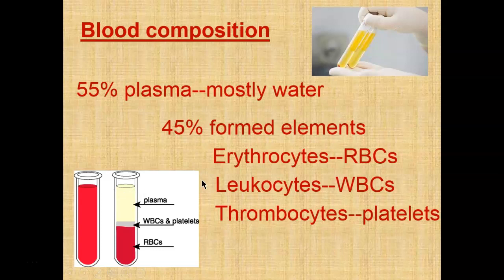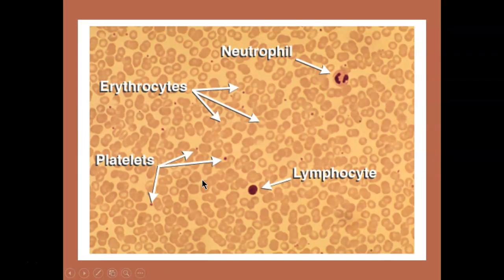Here you see a normal blood smear. The most numerous cell type are the erythrocytes — your red blood cells. They are very small and biconcave in shape, like a biscuit dough that's been squished with two depressions on each side. Erythrocytes begin their life cycle with a nucleus — needed to make proteins and hemoglobin — but when mature they eject the nucleus, becoming little bags of hemoglobin. This gives them the biconcave shape and more surface area to carry oxygen.